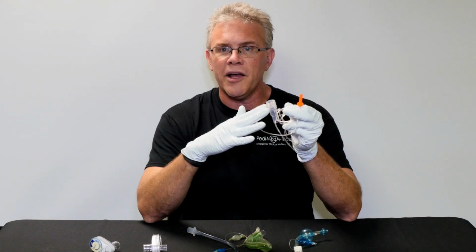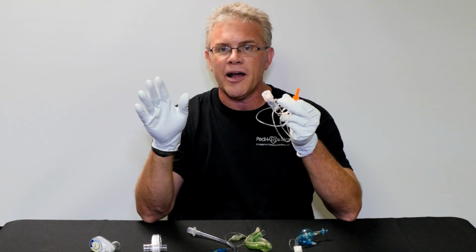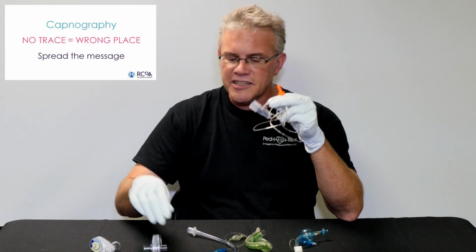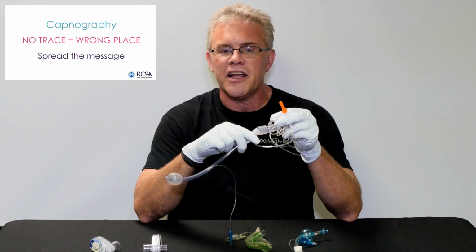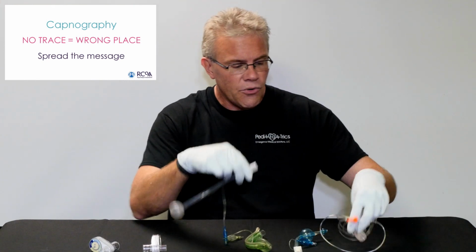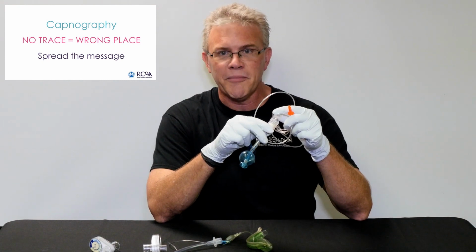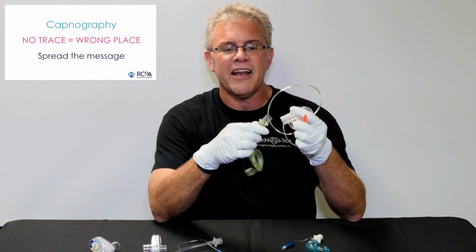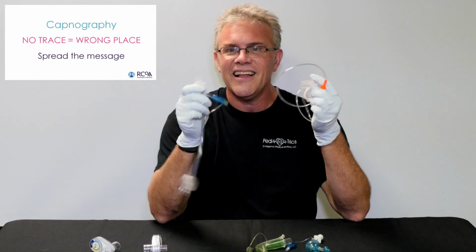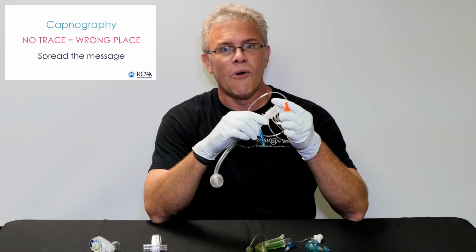And what you want to come away with is simple. If you remember nothing else, anesthesia over in the UK, their motto is called no trace, wrong place. Meaning you hook this on the end of a tube and it doesn't give you a pretty waveform, no trace, wrong place. If you hook it on the end of a king airway, no trace, wrong place. You hook it on the end of an LMA, no trace, wrong place. Or again, on an endo tube, I hope you're noticing the trend, no trace, wrong place.